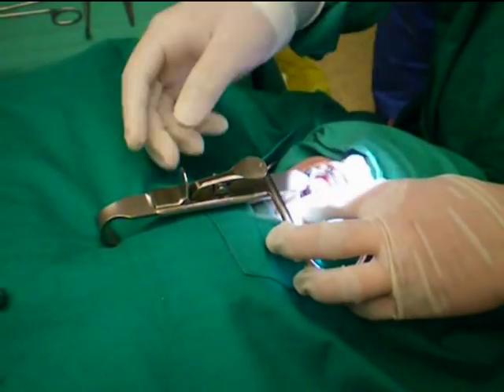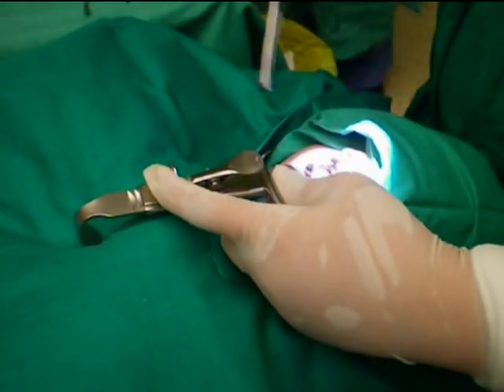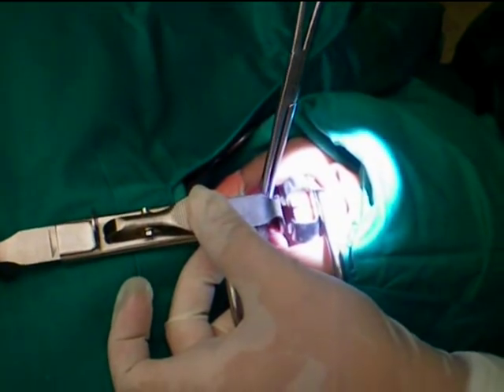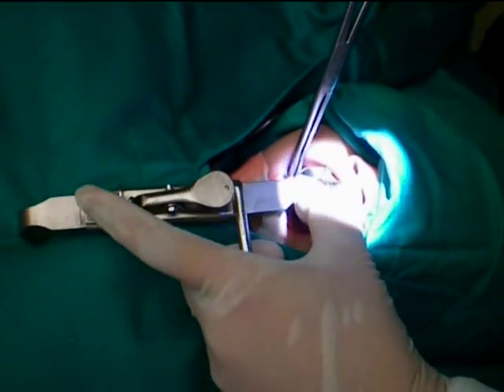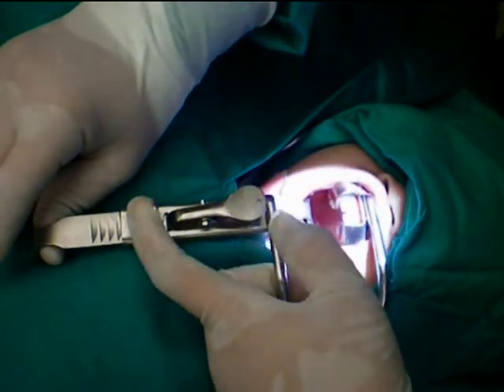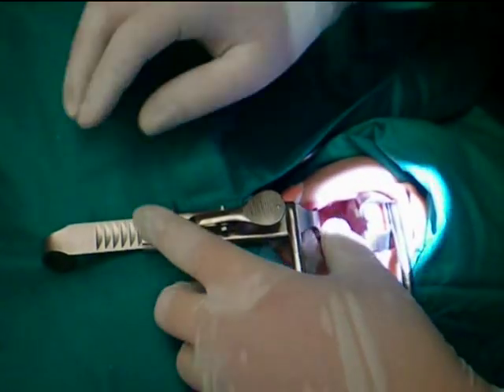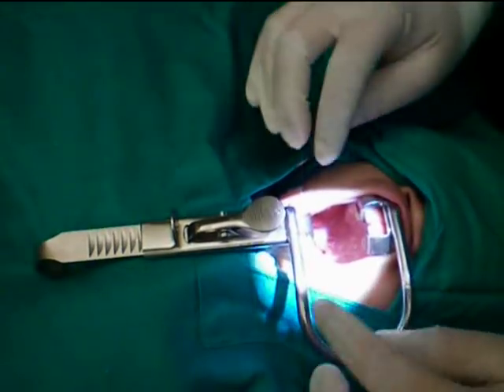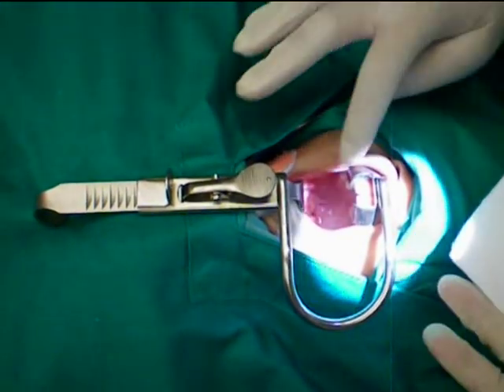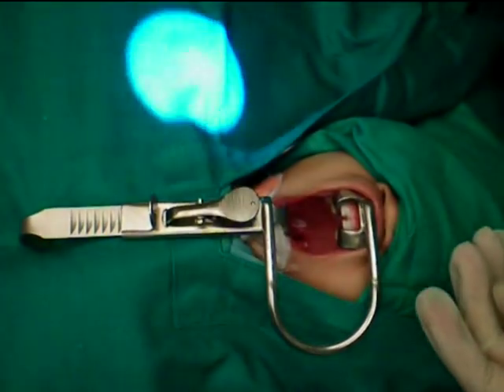After prepping the patient, the Boyle Davis mouth gag with an appropriately sized blade is applied. Retract the blade gently, taking care not to over-retract so as to not cause any damage to the lips, buccal mucosa, and the TMJ joint. Always ensure adequate lubrication is applied to the lips.